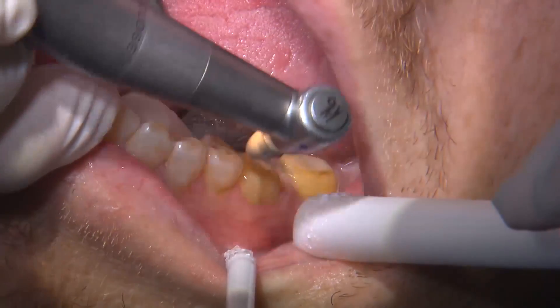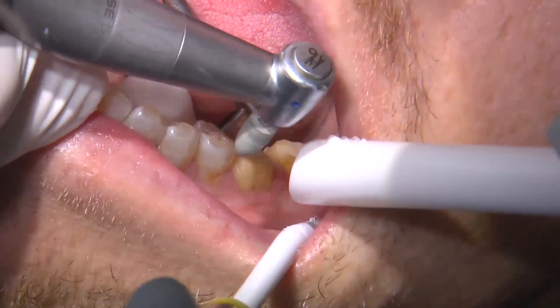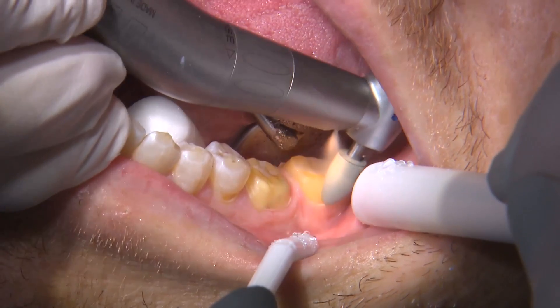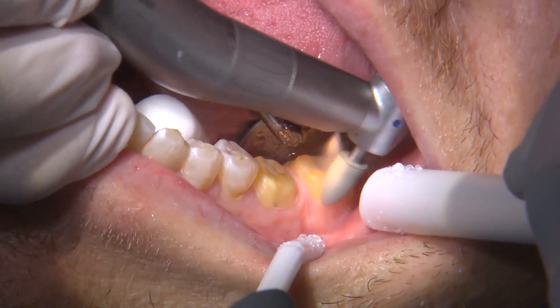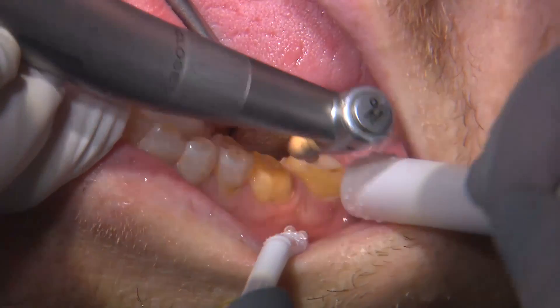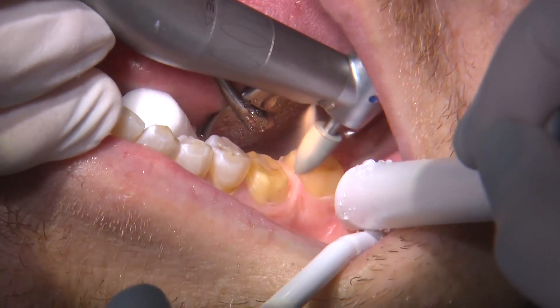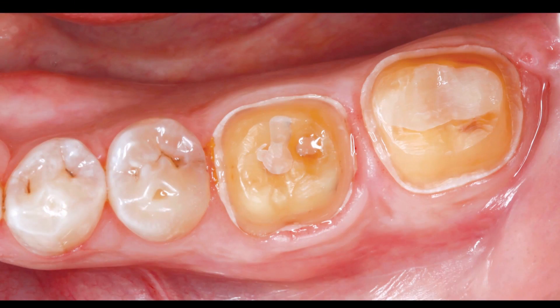Sometimes I do like to take a composite rubber wheel to help roll over the sharp angles. We do want rounded internal angles whenever we prescribe all-ceramic restorations, and especially in this case when you're milling restorations — the rounder you can make those internal angles, the easier it will be for the mill to mill these restorations. Here are the final preparations, with enough reduction occlusally and axially.